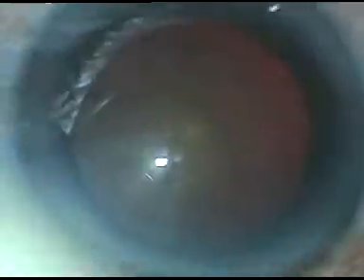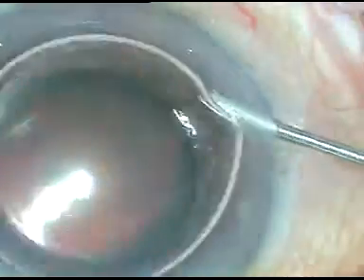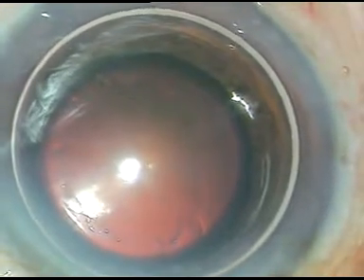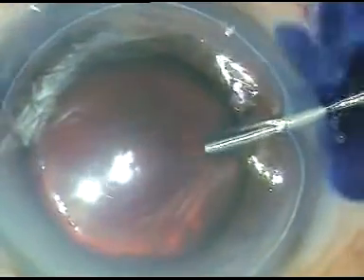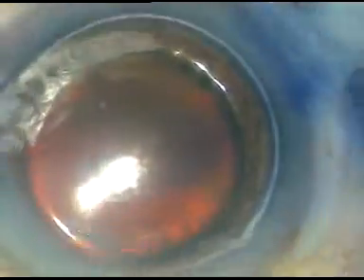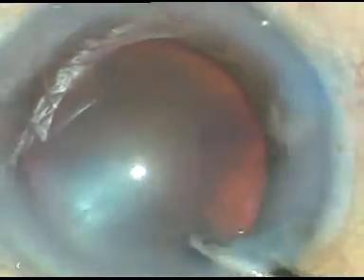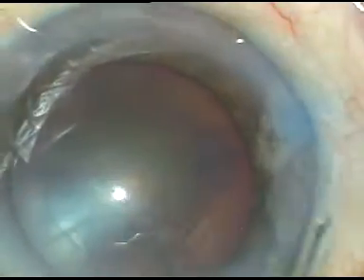As you can see, this is a case with brown cataract and pseudo-exfoliation. At this moment, trypan blue dye is being injected underneath a big air bubble. This is to visualize the anterior capsule and the margin of the pseudo-exfoliation. You can see as if a rhexis has been done — actually, this is the margin of the pseudo-exfoliation.